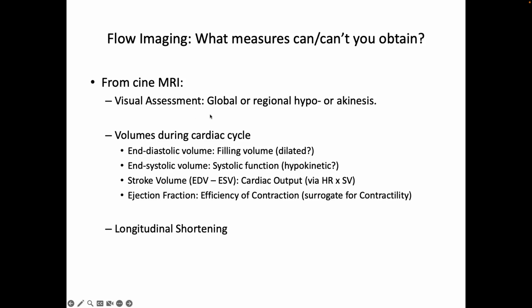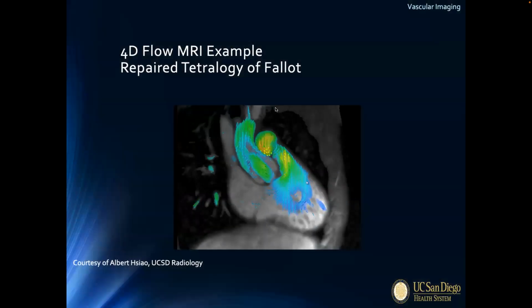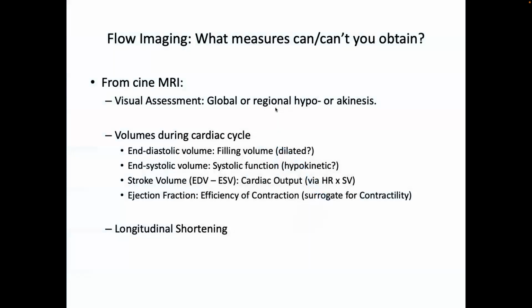So you can look at the cine MRIs, and you can get immediate appreciation of some flow that isn't happening, right? If you had flow stasis in, say, the apex of the RV, you can see that right away. So you can compute all of these things that are computed with echocardiography in terms of flow rates through different vessels, etc. You can also compute them.